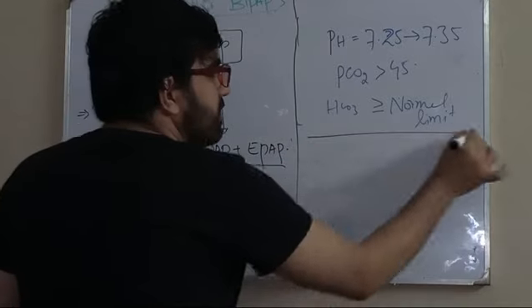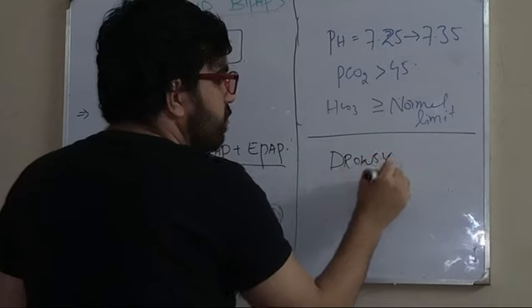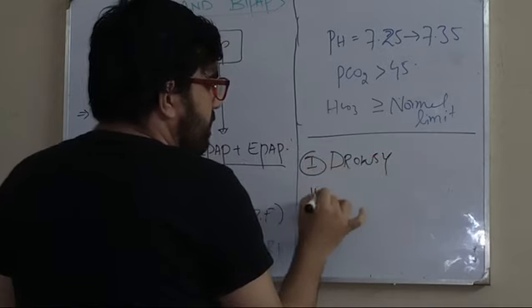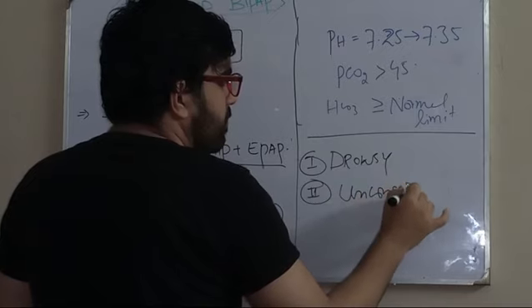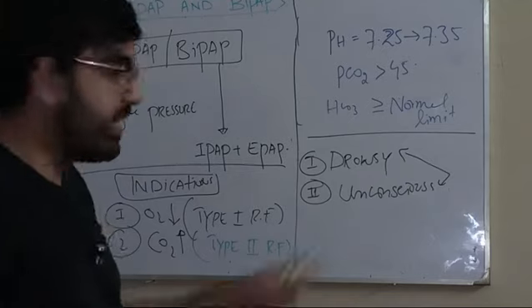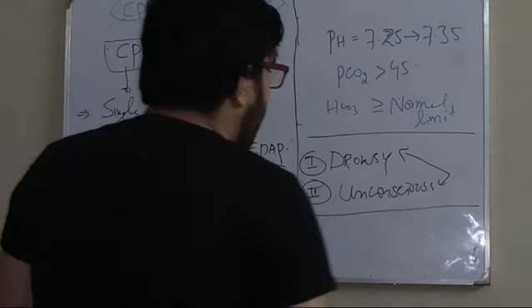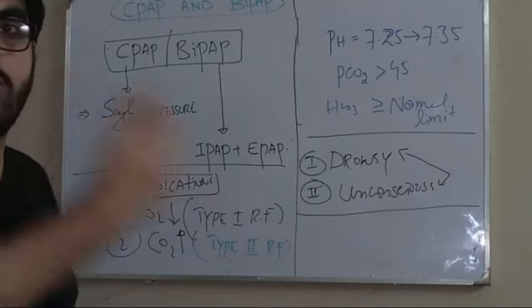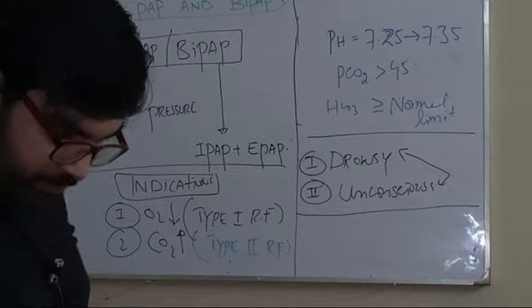You cannot use it if the person is drowsy, if the person is unconscious. In both these two conditions, ventilator is the answer, because the person cannot wash out the CO2. So that was the main thing.